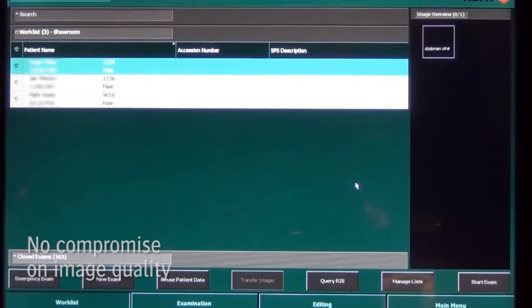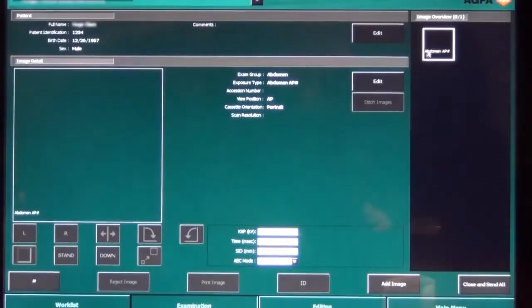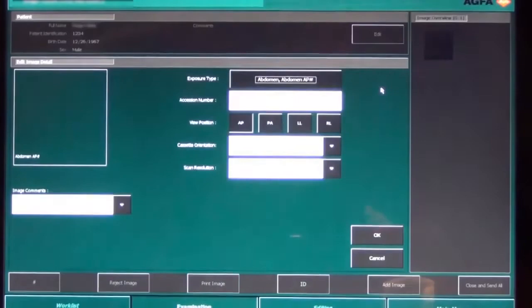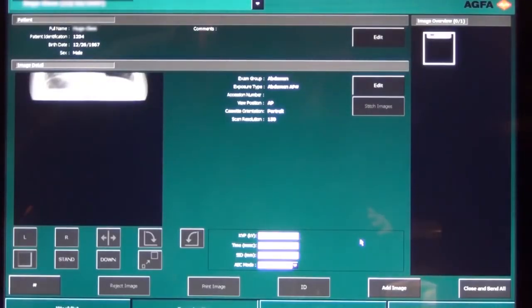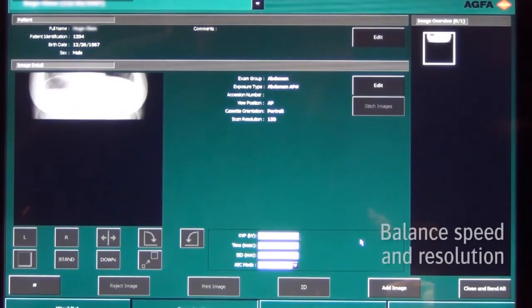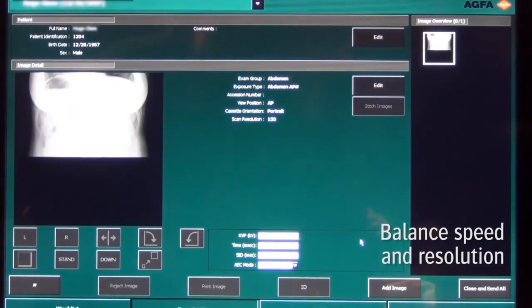Select the patient in the work list for an emergent abdominal examination. Due to the urgency of this case, the user chooses for an optimal balance between speed and resolution.